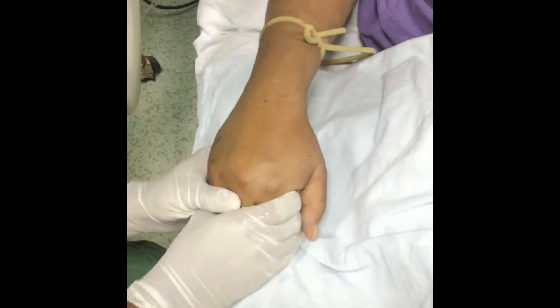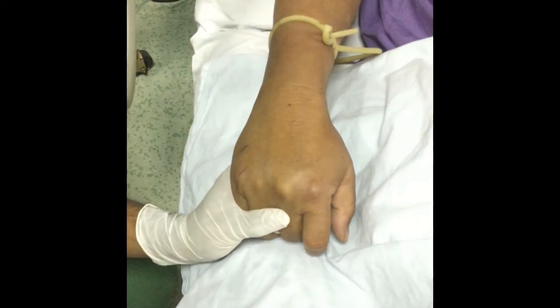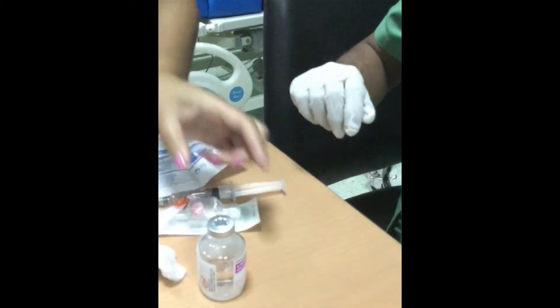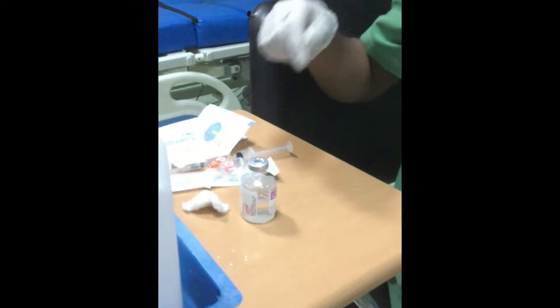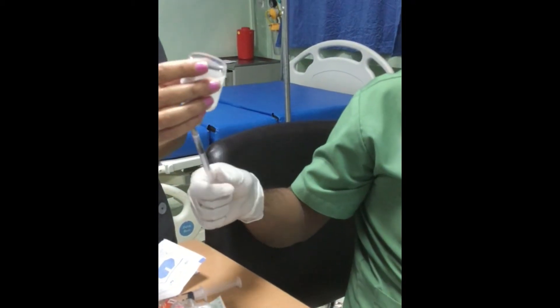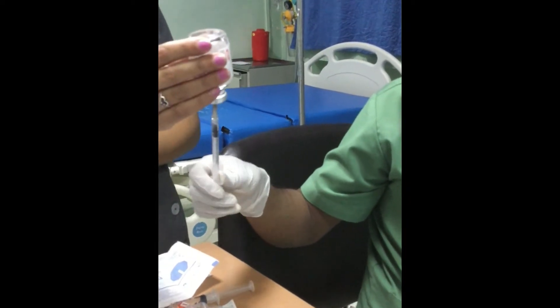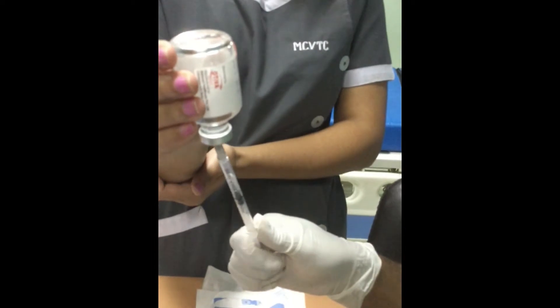Ask your patient to make a fist and to open and close the fist several times. If not possible, passively contract and relax the hand below the IV cannulation site. The arm should be positioned below the level of the heart to encourage venous filling.